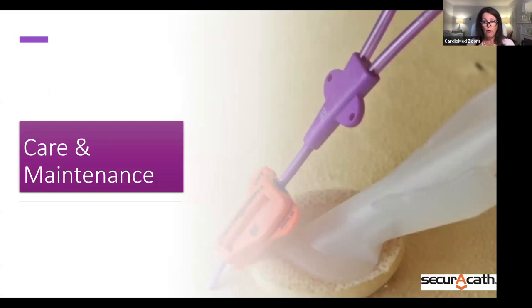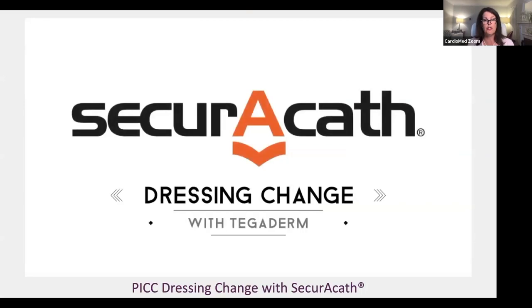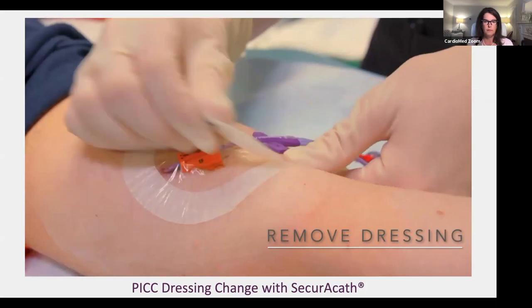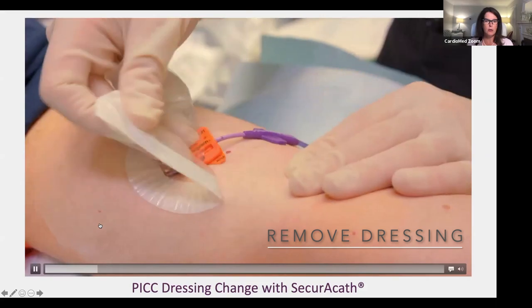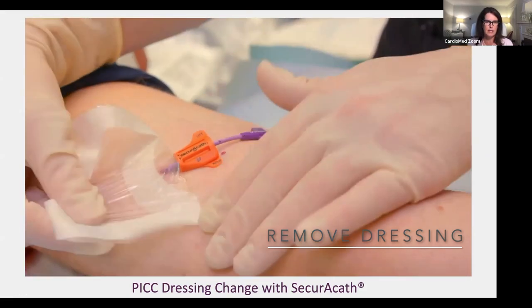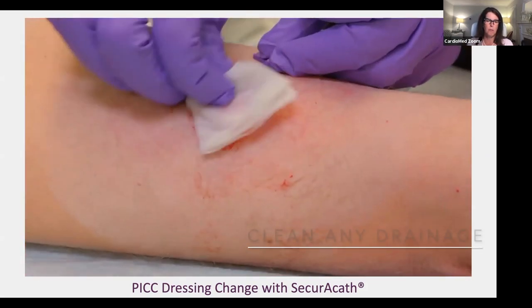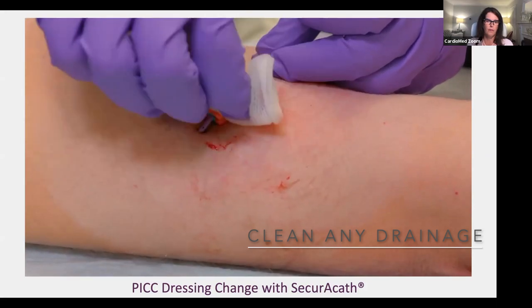What is going to be your role in taking care of these patients and their PICCs with the SecurAcath? Here's a video that shows how to change a dressing with SecurAcath. Remove dressing. So you're going to remove the dressing low and slow so that you're not causing any trauma to the skin as you're removing it. And you can see the SecurAcath in place. If blood is present on the SecurAcath device, use a sterile saline-soaked gauze to dissolve and remove it.